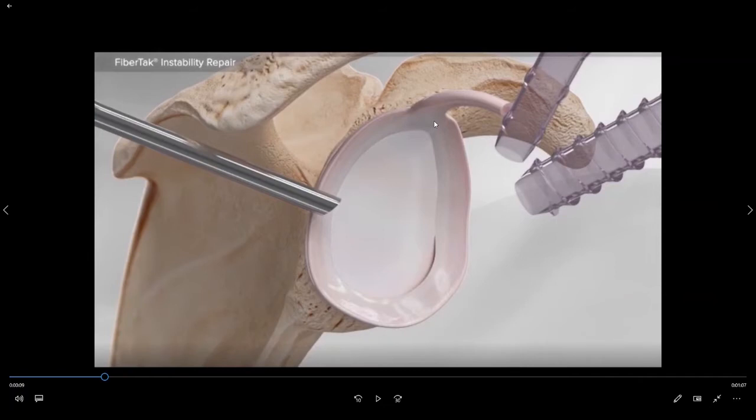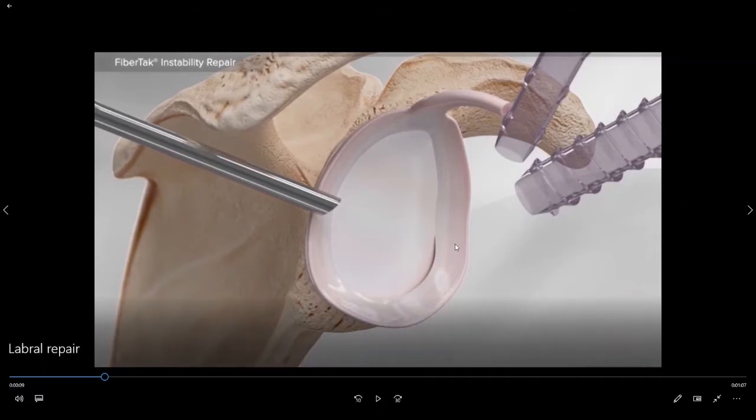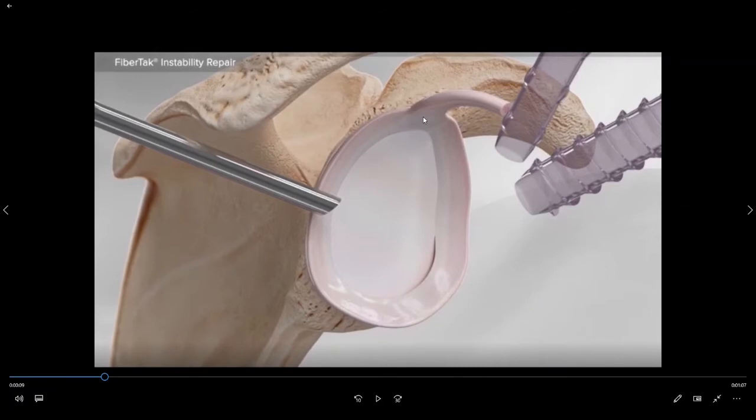Because the socket of the shoulder is relatively shallow compared to the large diameter of the ball, there is not a lot of constraint to the shoulder joint provided by the bone of the socket itself. And so one of the structures that helps to keep the ball centered in the socket is this rim of cartilage called the labrum. This cartilage is like the cartilage in your ear. It is soft and it can be damaged or tear.